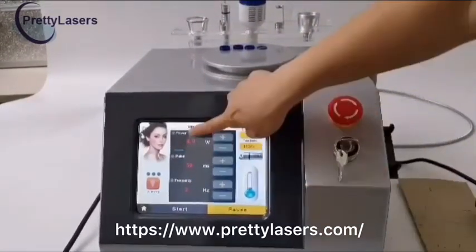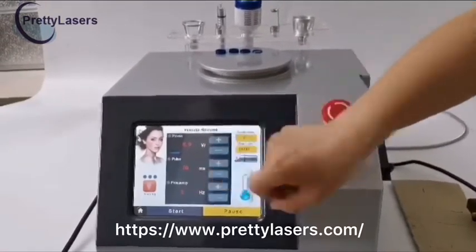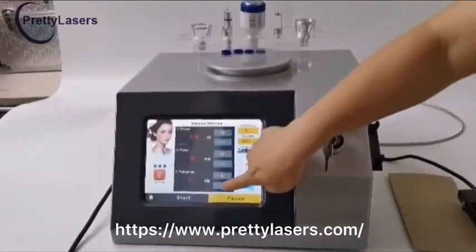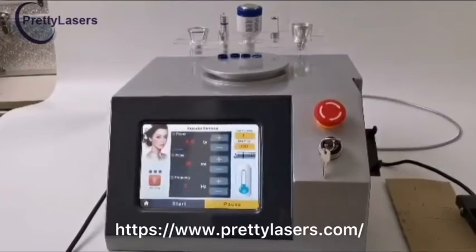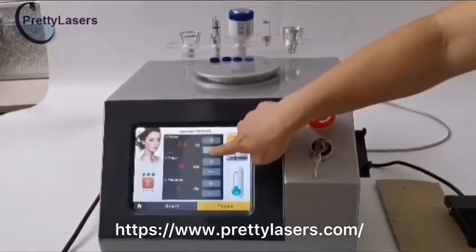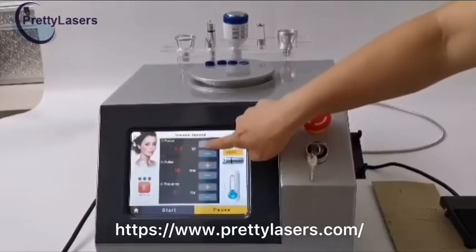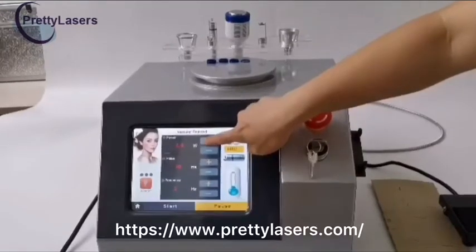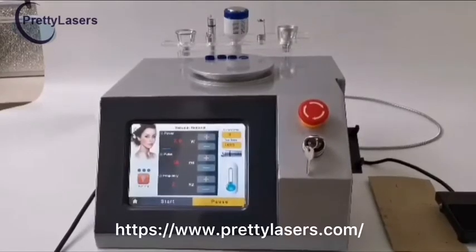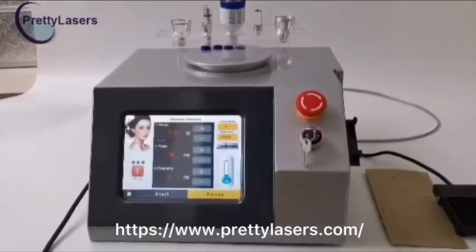This is Power. This is Pulse Width. And this is Frequency. Click the plus and minus buttons to adjust the parameters. Power value minimum is 0.5 W and maximum is 13 W. When operating on the skin, if this value is too small it will not work; if too large, it will burn and blister. Common use range is 6 to 12 W.